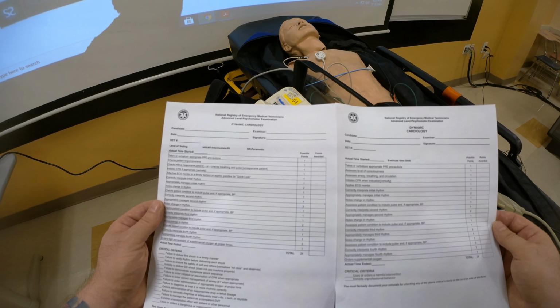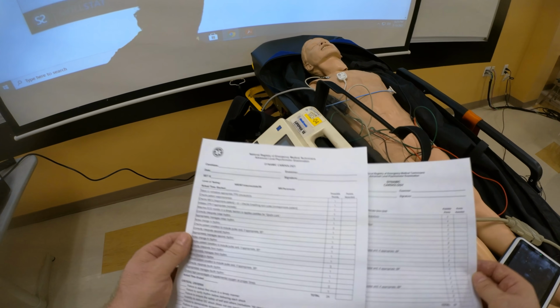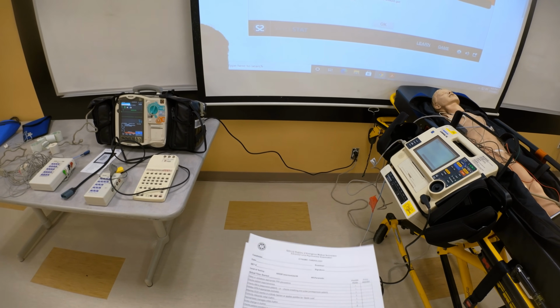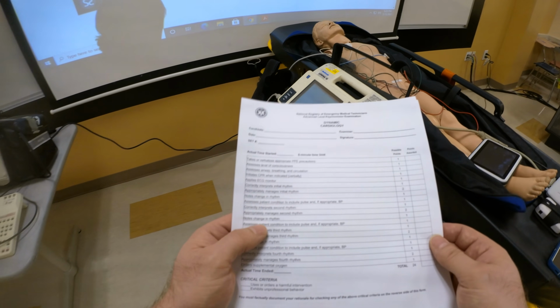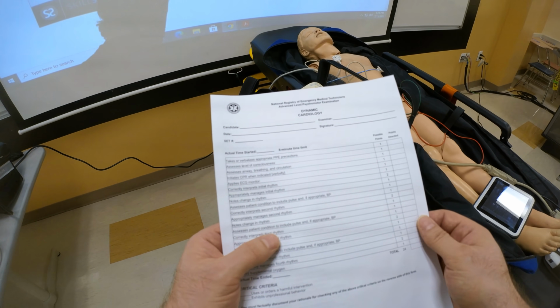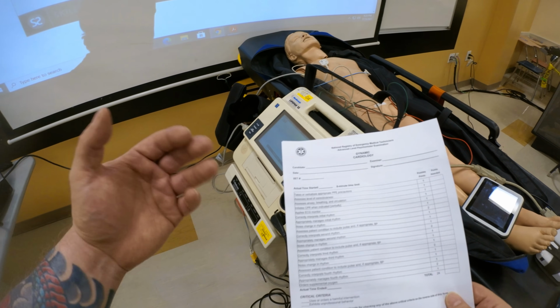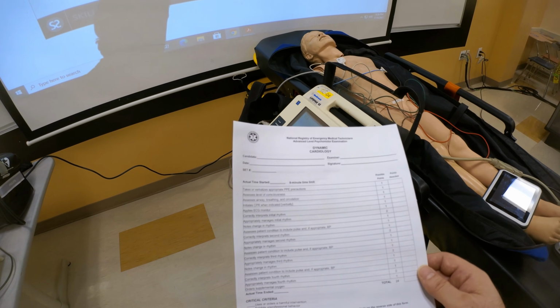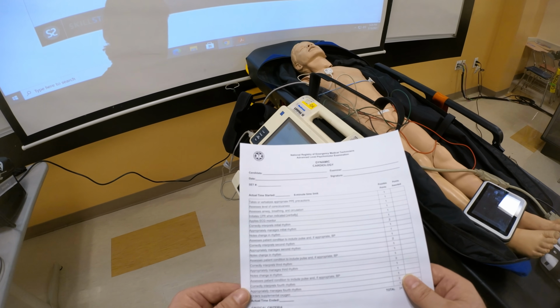And if you're the student and your instructor says, okay, we're testing or we're practicing dynamic cardiology, right? And all you see is this type of screen, right? And you're sitting on your chair and the instructor tells you, all right, we're just going to verbalize everything. You need to then say, all right, I looked at the skill sheet and the skill sheet clearly says applies ECG monitor, right? It says appropriately manages initial rhythm, right? Correctly interprets the second rhythm, right? Appropriately manages the rhythm. Does that mean we actually have to perform it? So ask this question, right? And if you're still not sure, the instructor is still not sure, find the CIC, right, the instructor coordinator, and ask him how the station should be conducted.